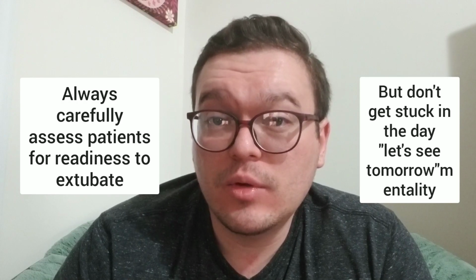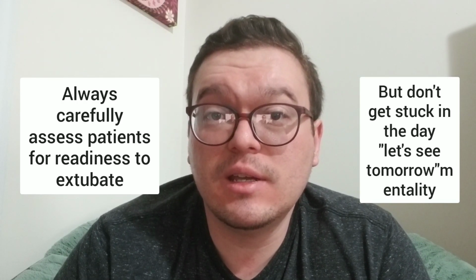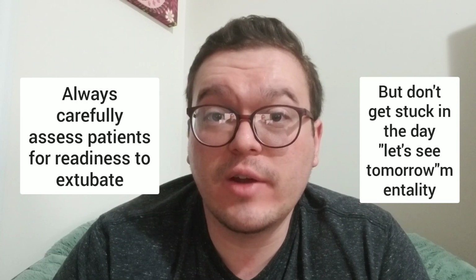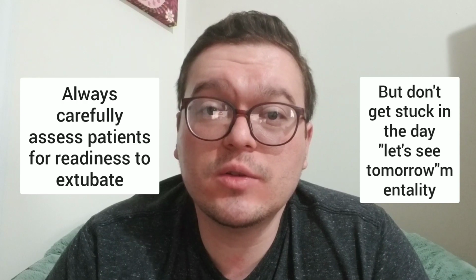Now, that is understandable, but in a controlled hospital environment, patients can be ventilated non-invasively until either anesthesia or someone else can show up and reintubate the patient. So under most scenarios, it almost behooves you to be a little bit more aggressive rather than apprehensive. Particularly in a pandemic like this, where we're very short on supplies and we need everything that we have.